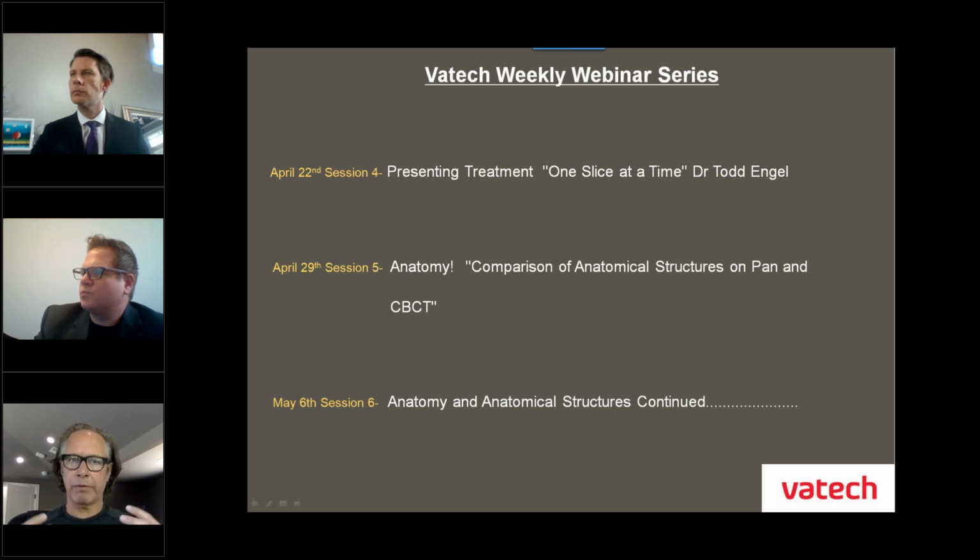So if I could tell you anything, it's don't be intimidated by this, because if you look at the whole pie at once, it can be. Just look at it slice by slice. That's funny, no pun intended, but do it. Look at it slice by slice, and there's no way you could eat the pie at one sitting. Just understand that it's going to be a great tool for you as a clinician.